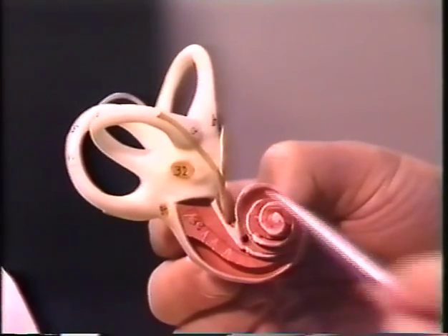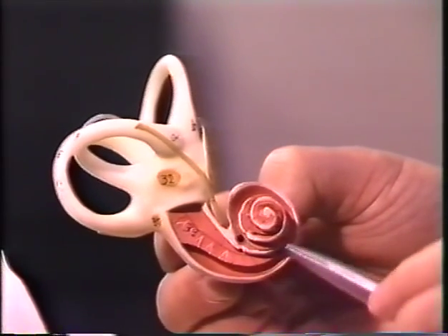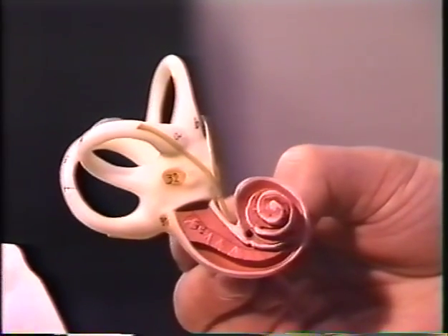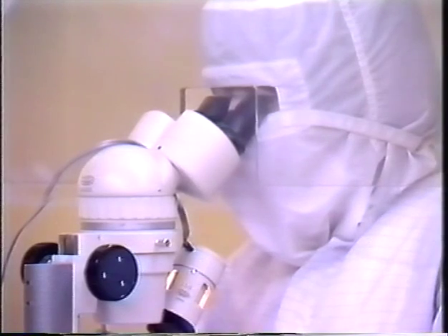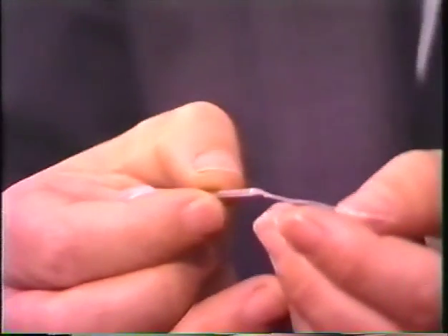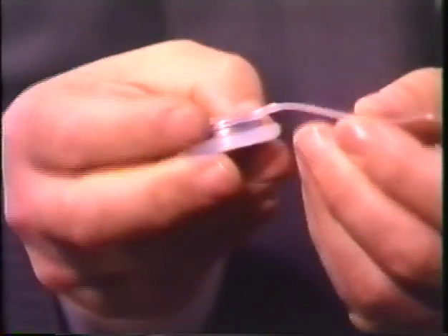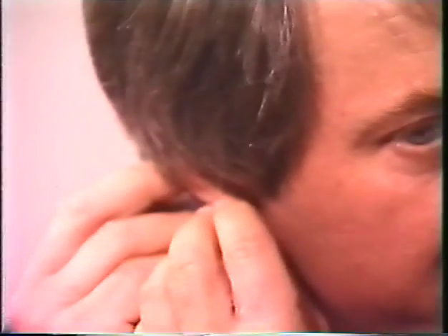The concept behind the cochlear implant is to place an electrode inside the shell of the inner ear so that it can stimulate the remaining nerve fibers direct, bypassing the faulty hairs. The implant device is manufactured in Sydney by Cochlear, a subsidiary of Nucleus Limited, and it is exported now throughout the world. Here you can see there are 22 tiny electrodes which are connected by wires which pass into the body of the device. This device is implanted under the scalp with the tail passing down through the bone behind the ear and into the inner ear.